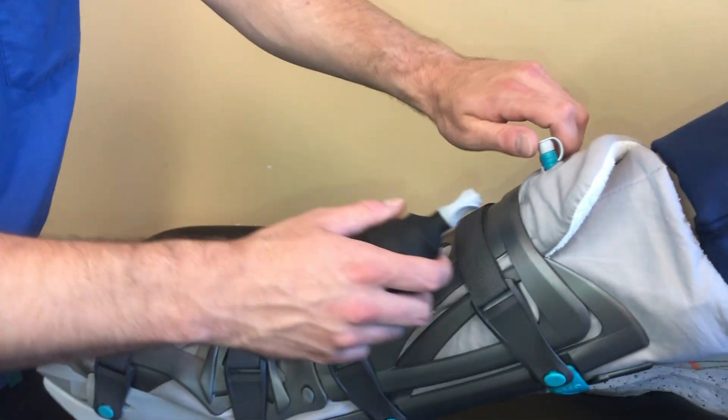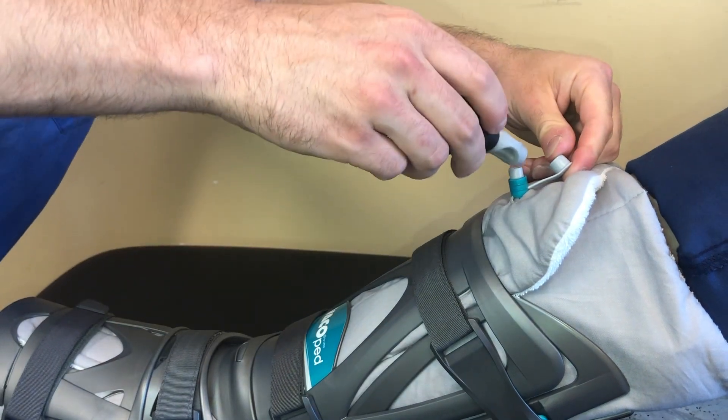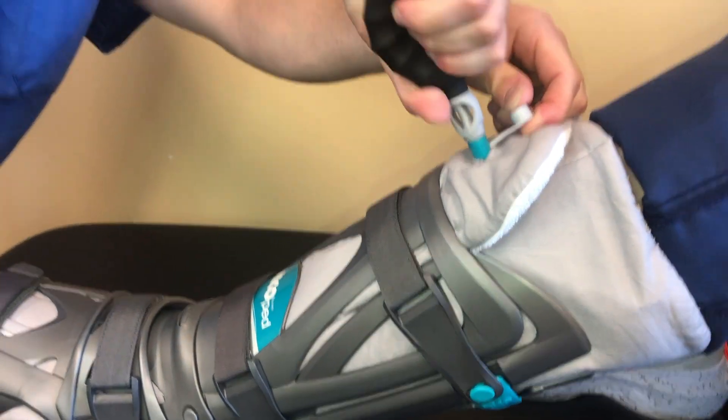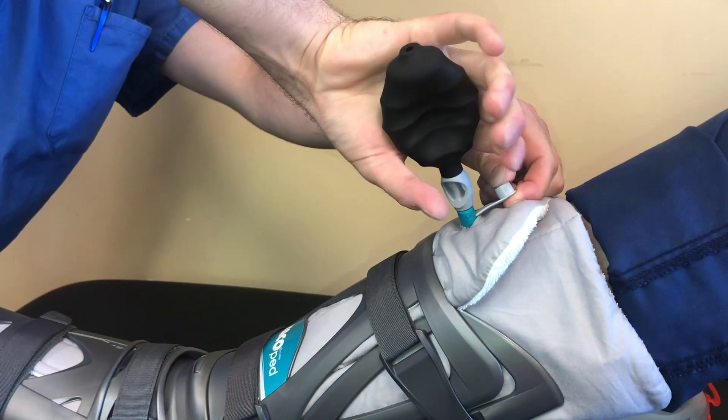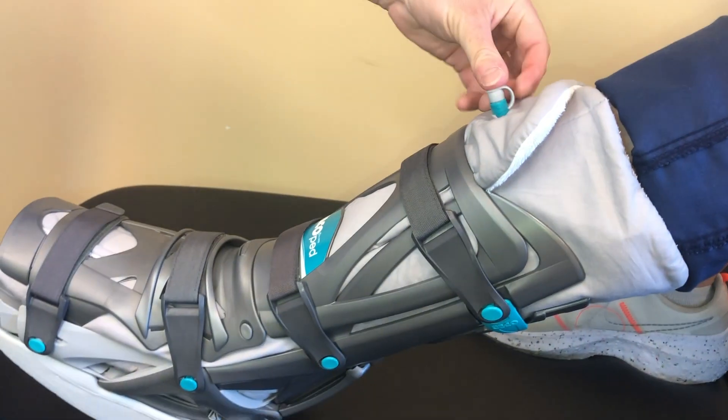If your foot is sliding in the boot or the liner feels soft, you may have not removed enough air. To fix this, simply reattach the pump and extract more air. You may need to detach and reattach the pump a few times in order to remove the excess air.